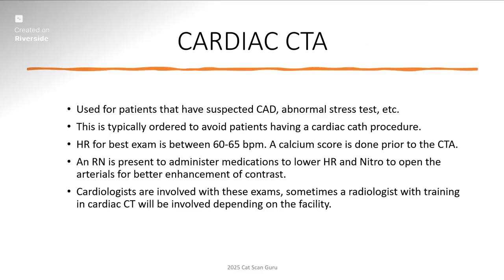Now, an RN is present to administer medications. They have to be there to administer medications such as the lopressor, which is your beta blocker, and the nitroglycerin. So beta blocker to lower the heart rate and nitroglycerin to open up those arteries so contrast can flow through it a lot better for better enhancement. So we always have to have an RN present for that.